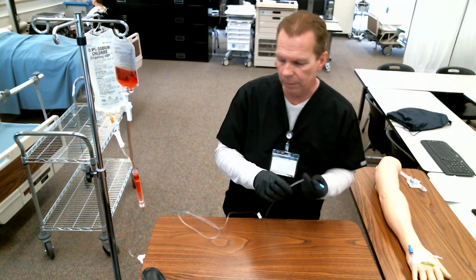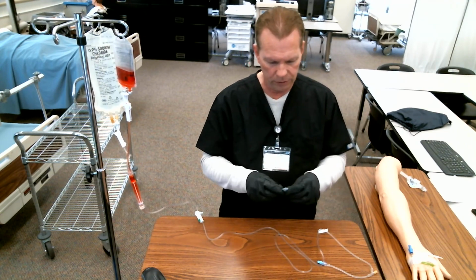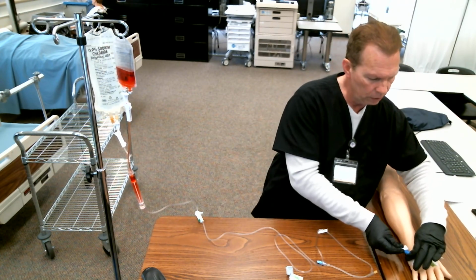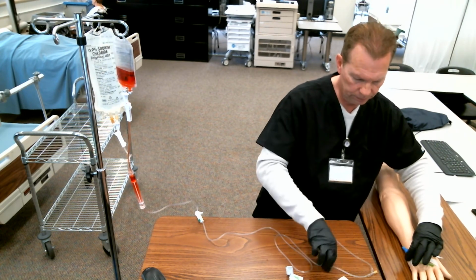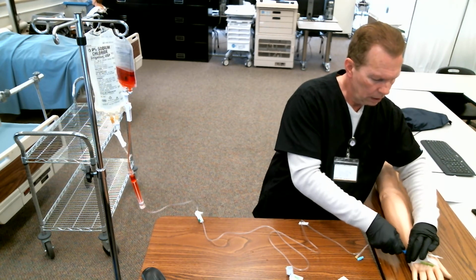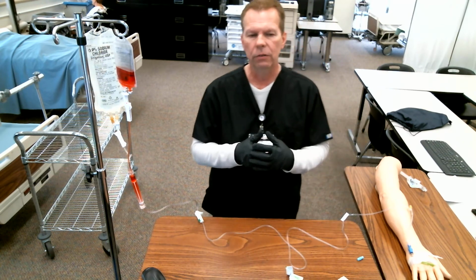All right, and so then I'm going to set my pump, get this in the pump. Just follow the directions like I said and get it in your pump so you're ready to go there. Then you're going to open up. We've already checked this by flushing it, so we're going to swab this off and connect that together. And if you need to, you can put a piece of tape on it or whatever you need to do. But we're going to go ahead and get it running.